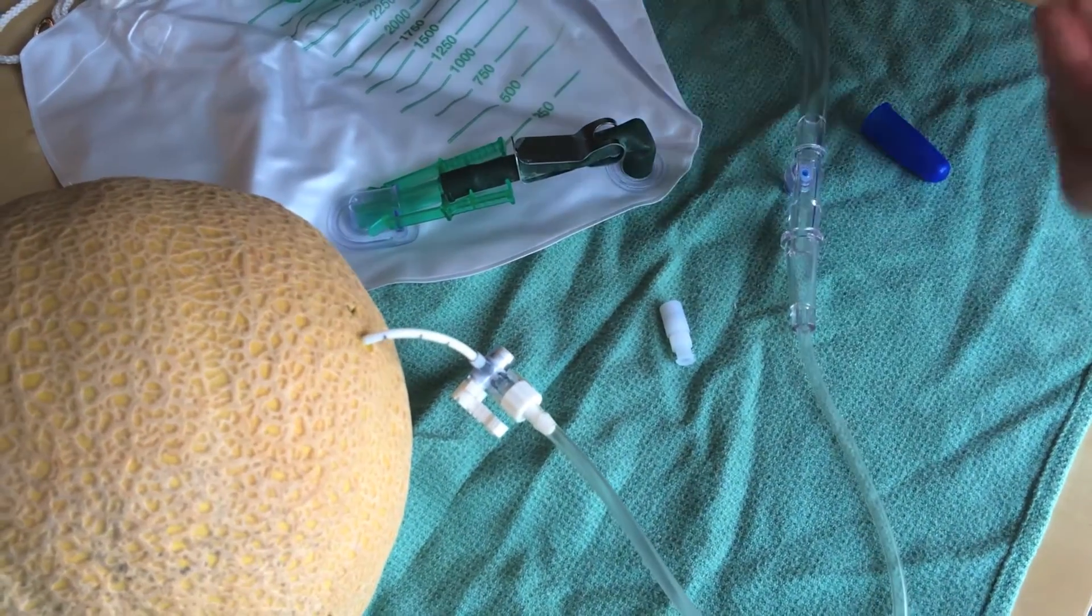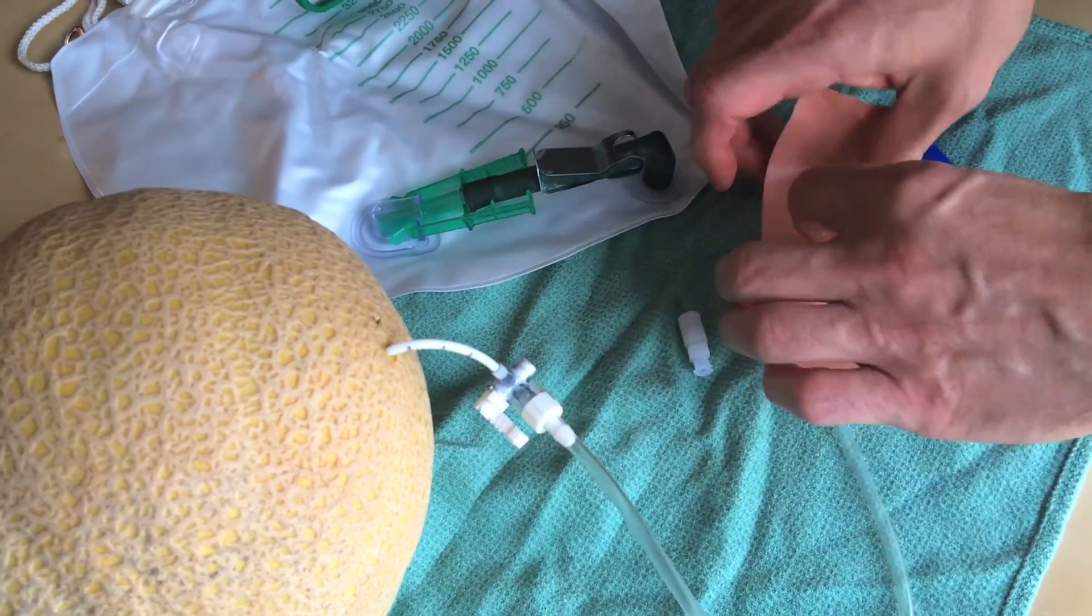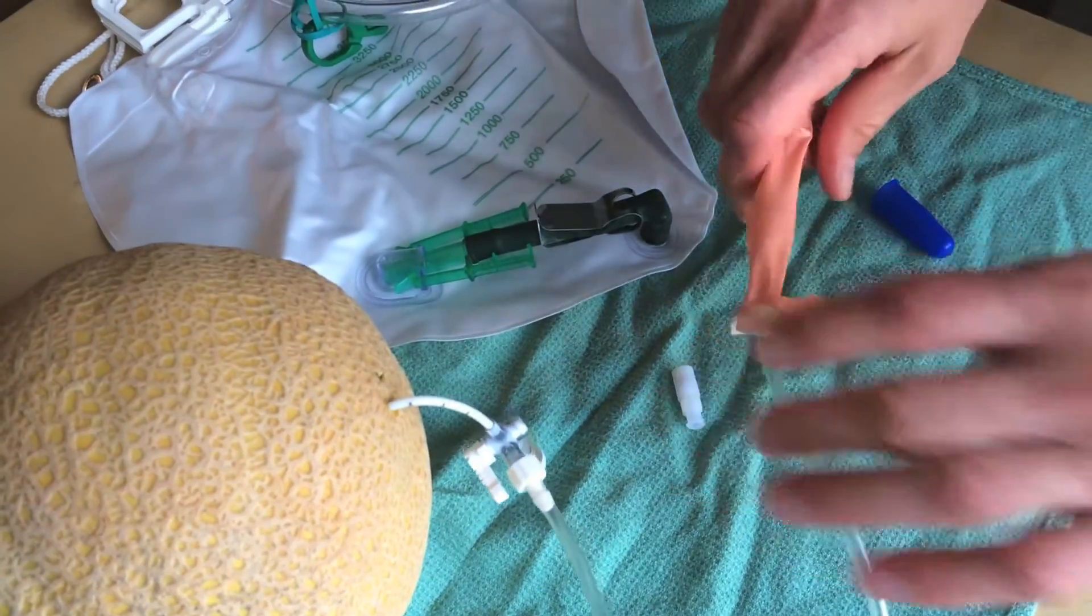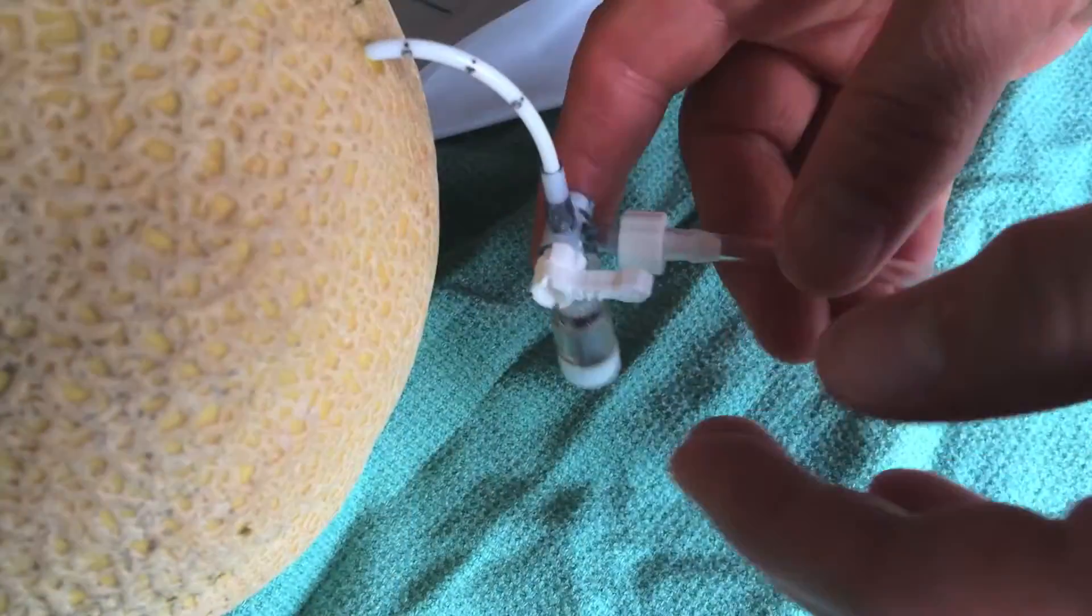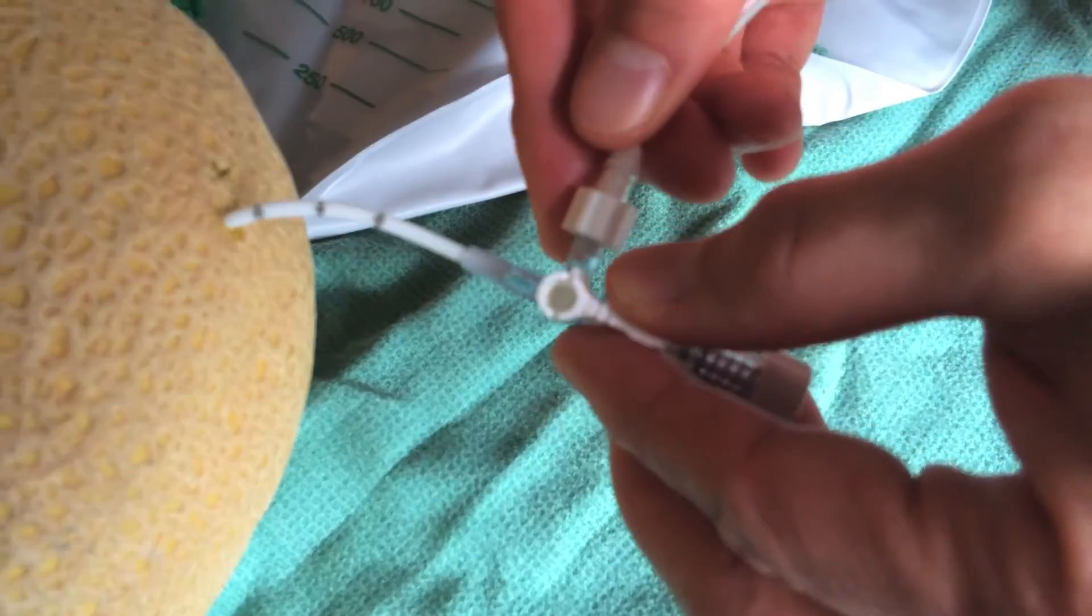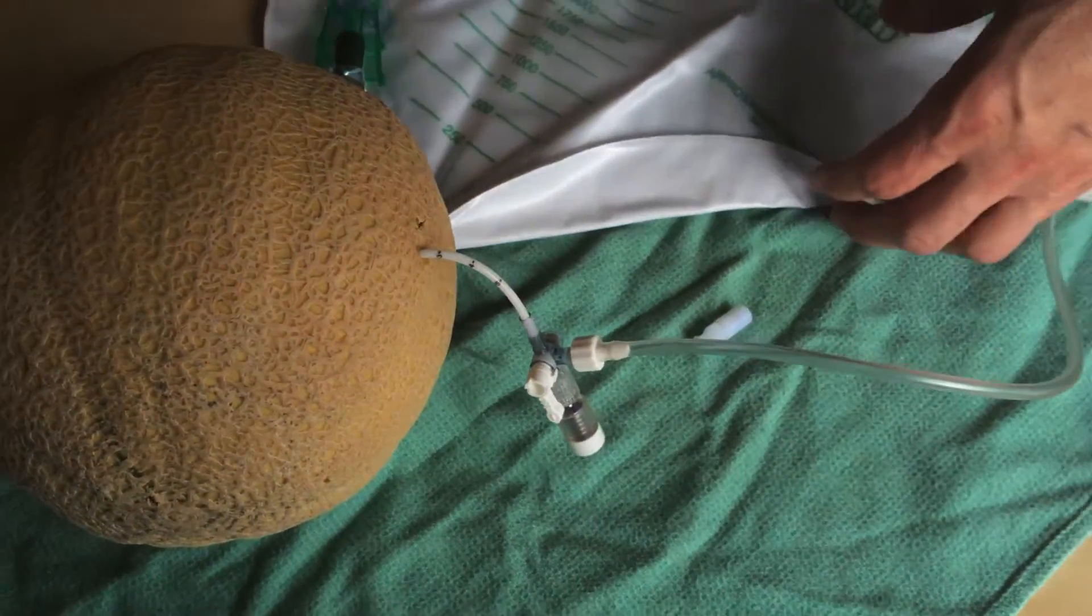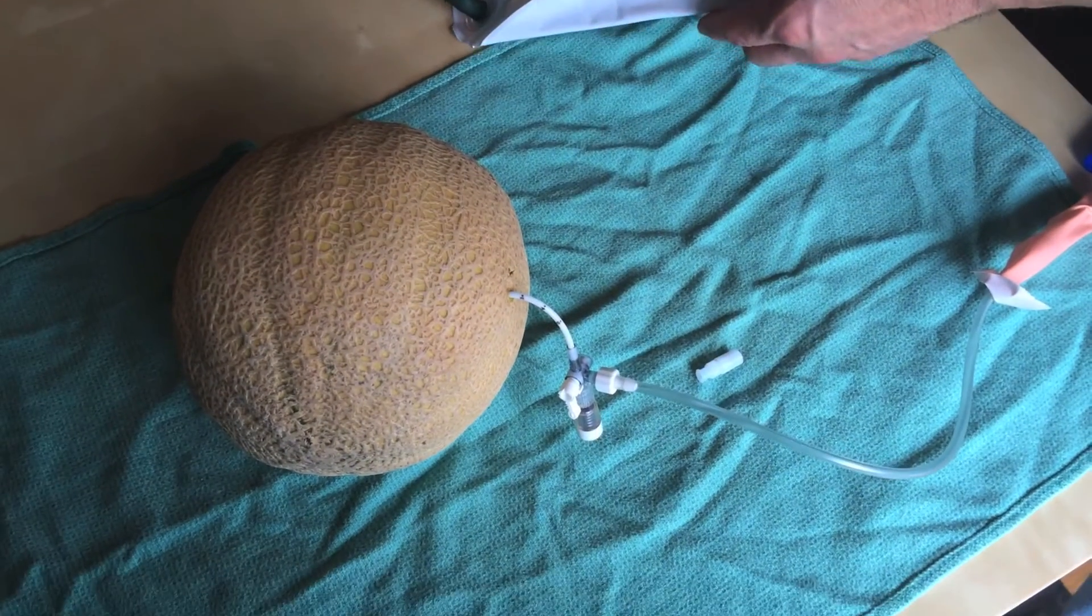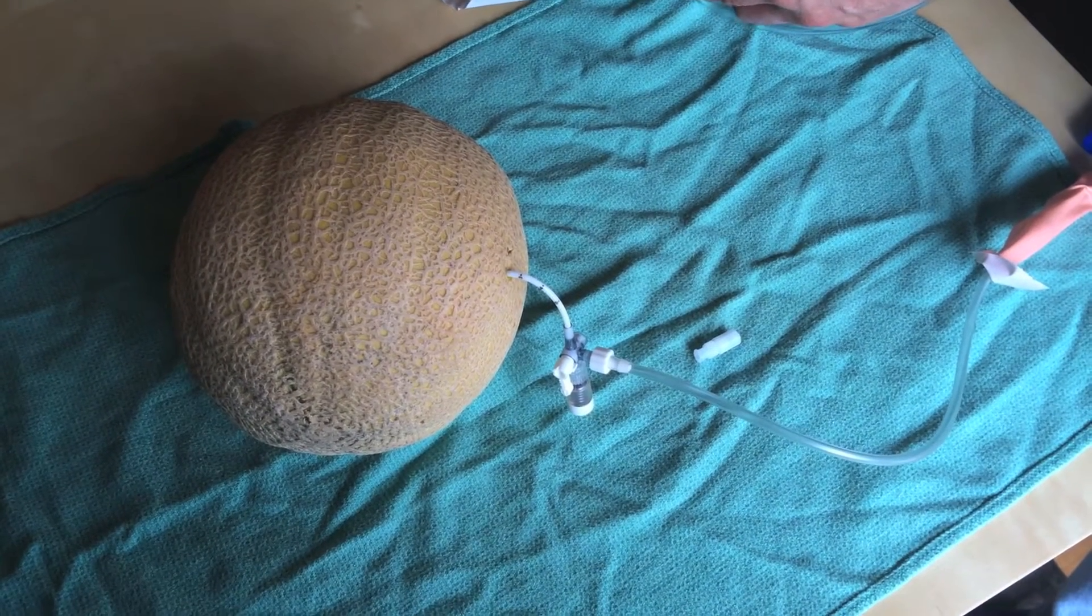You can secure this connection with a piece of pink tape. The next step is to turn the stopcock to the open position and place the bag on the floor to allow gravity drainage. It can accommodate up to four liters.